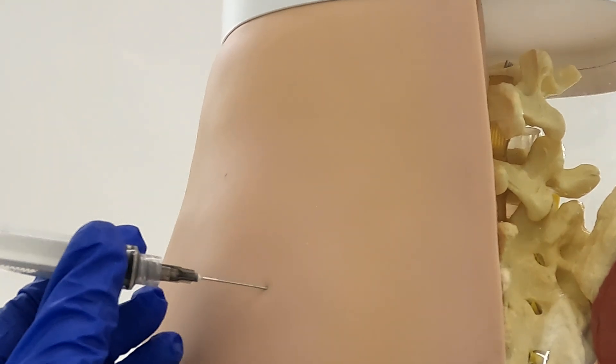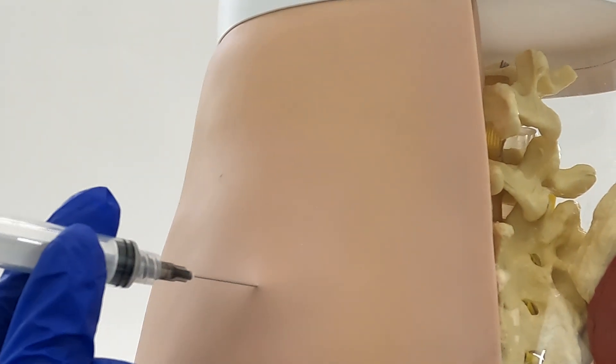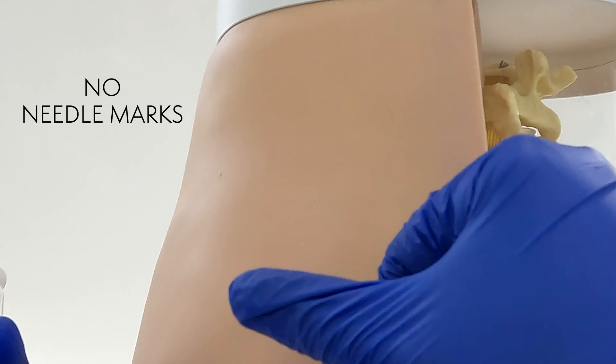Crafted from durable materials, this model allows for multiple injections without leaving needle marks.